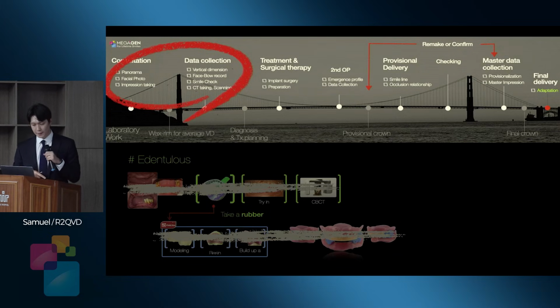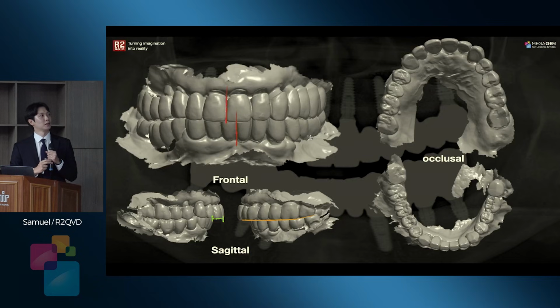And I will explain how to use the dental avatar. Why do we have to use the dental avatar? Because you have to share those 5 pieces of information with your technician. So for example, like this, almost 5 years ago, I did this case.